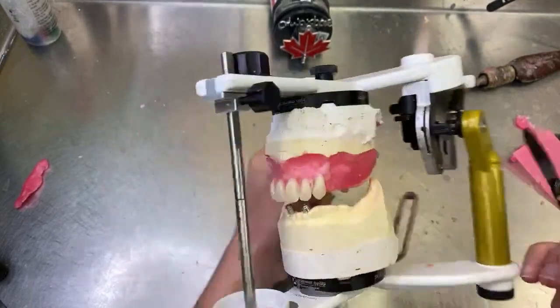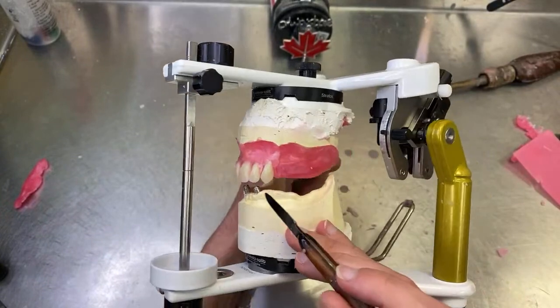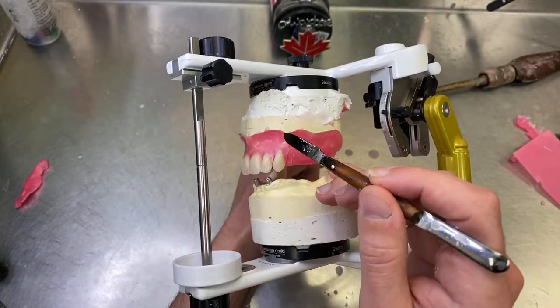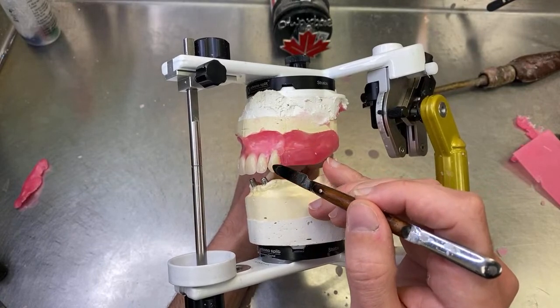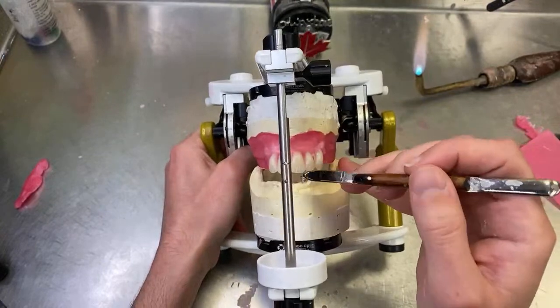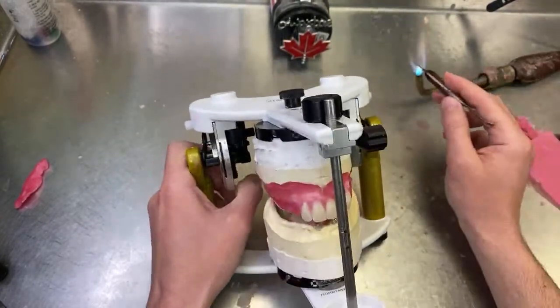So we all know how the canine sits on about like 15 degrees kind of tilt, and not excessive, just a little bit. You can see the main axis going straight line like this. Not like this, not like the central or the lateral, it goes like this. So that's what gives those natural looks.